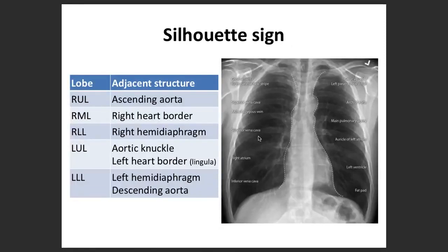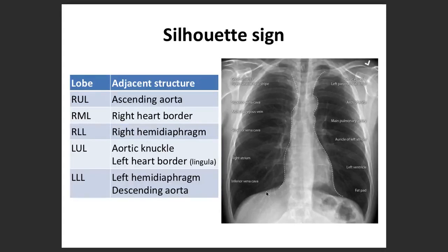One of the common signs is called the Silhouette sign. This is the cardiac Silhouette sign. Going along, the structures include the great vessels, the aortic arch, main pulmonary artery, left atrium auricle, the left ventricle, the IVC, RA, and SVC. These are the main structures, and of course the lobes as well.